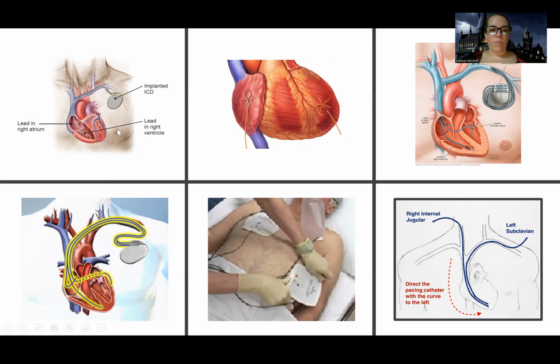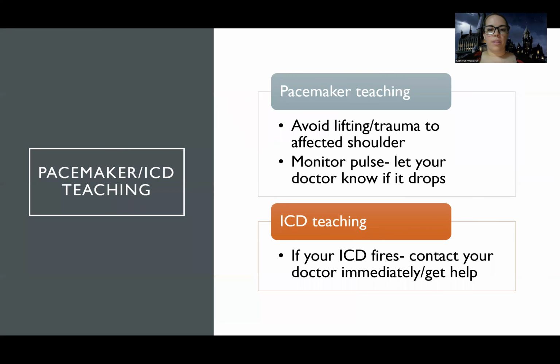And then you have up here what's called an ICD, or implantable cardioverter defibrillator. This is for patients that maybe need to be paced, but are also at risk for their heart stopping, sudden cardiac death. It helps to monitor their heart rhythm, and if they go into ventricular fibrillation or ventricular tachycardia, it actually shocks them. So much fun.